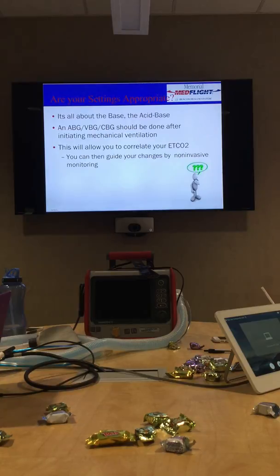So kind of just a real quick overview, what's the point of ventilation, or what are we targeting? It's your acid-base balance for us. You're wanting to make sure that your ABG, their pH is correct, looking at your PCO2, at your PO2, and also the very important correlating your end-tidal CO2 when you draw your gas to make sure that your targets are appropriate. How much change in your pH happens if you change your PCO2 by 10? 0.08. Very good. A star for you. Have a chocolate.